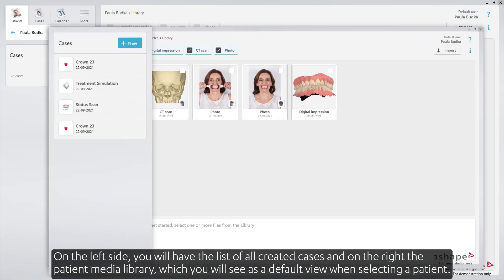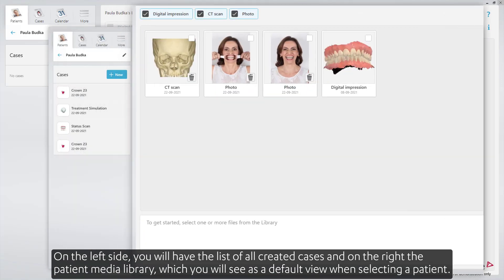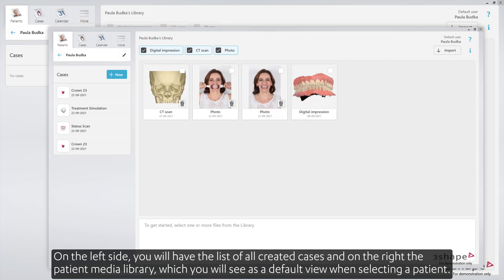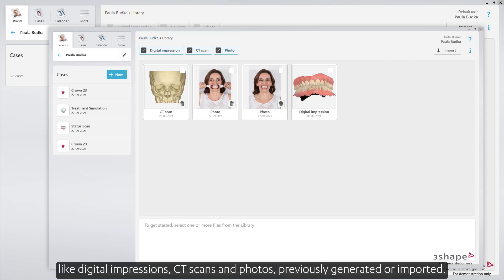On the left side, you'll have the list of all created cases, and on the right, the patient media library, which you'll see as a default view when selecting a patient. Here you'll see an overview of all files which have been imported for this patient, like digital impressions, CT scans and photos, previously generated or imported.